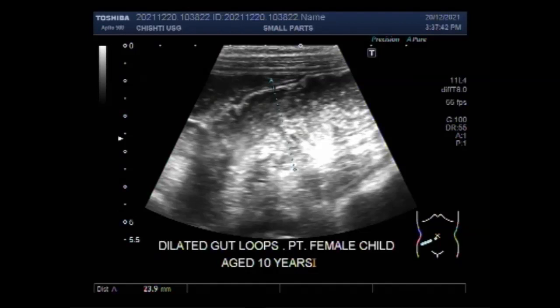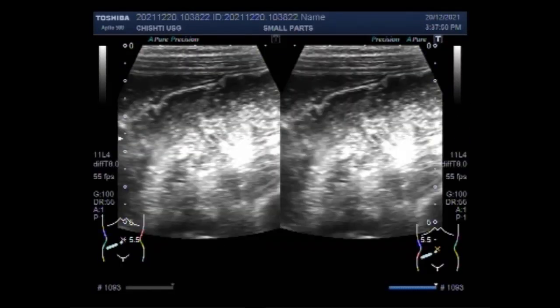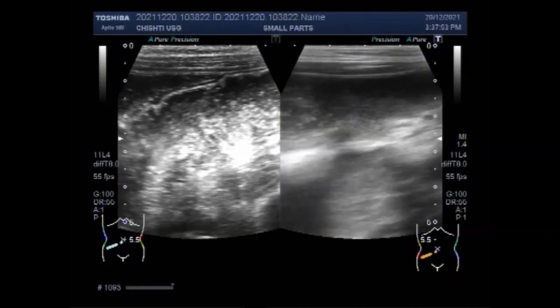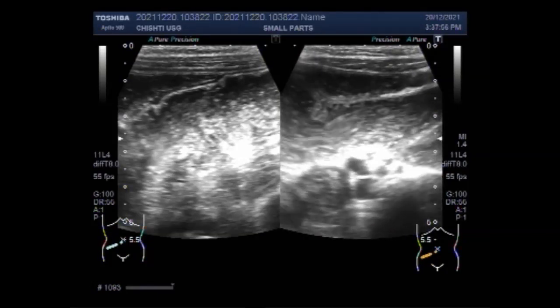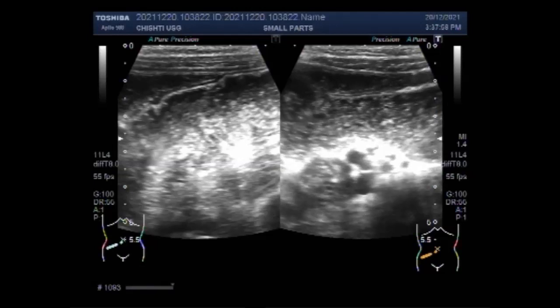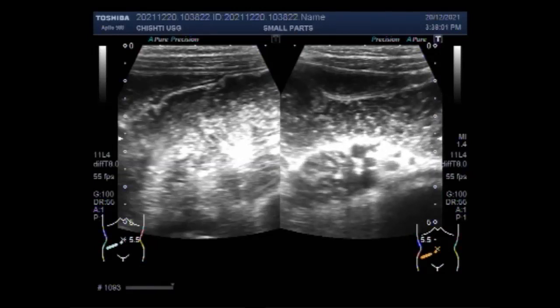The intestinal diameter is 23.9 mm and the patient is a female child. The gut loops are dilated and you can see the movements of the intestinal contents.